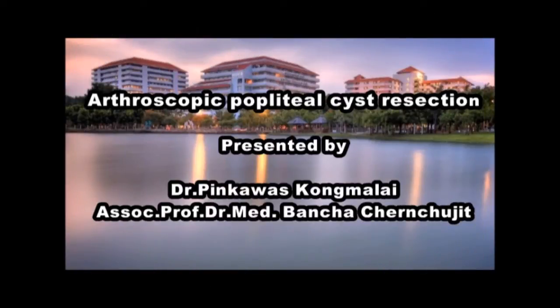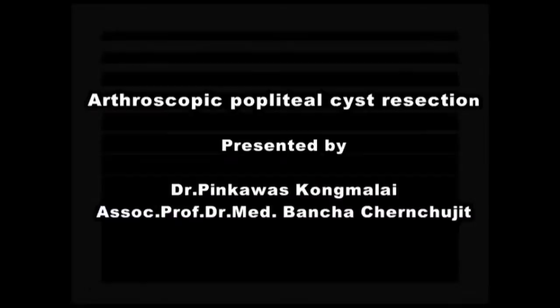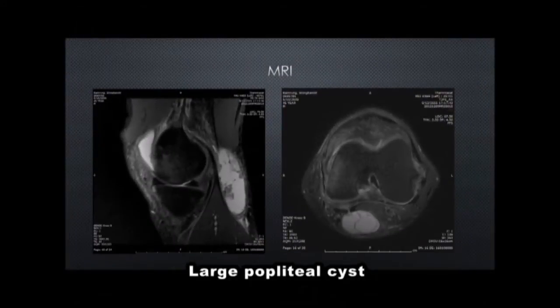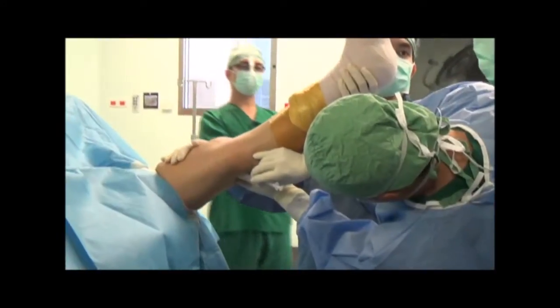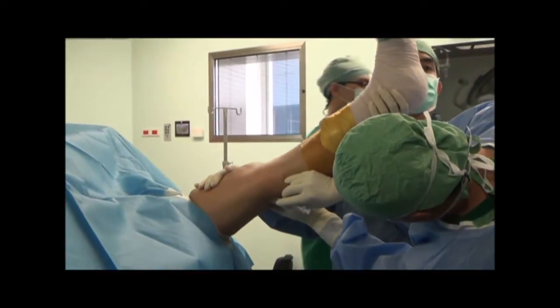Arthroscopic Baker's Cyst Resection. The MRI of a 46-year-old male showed a large Baker's cyst behind his left knee.